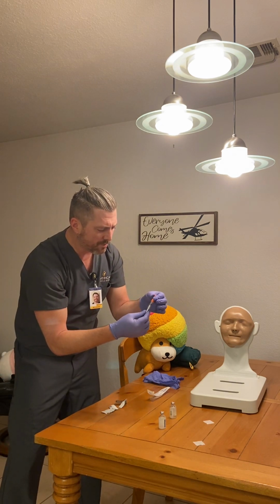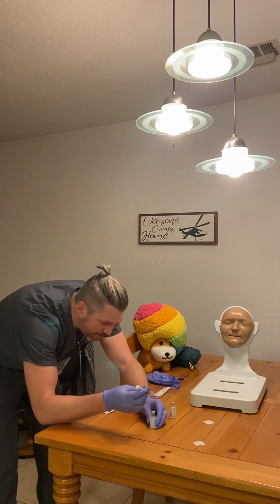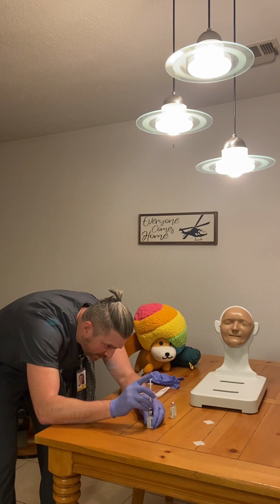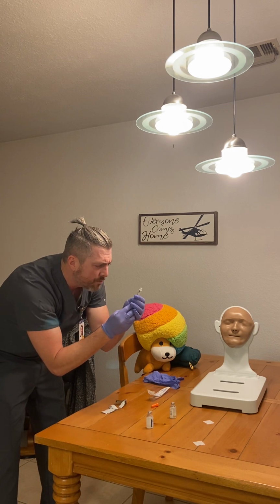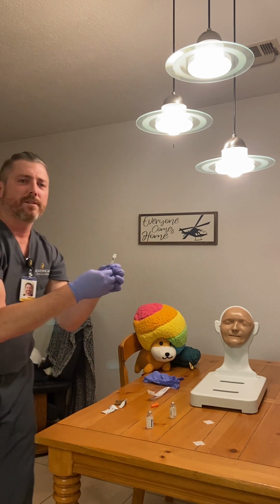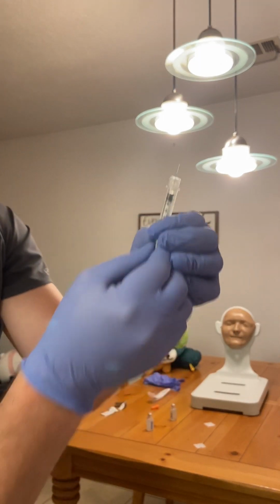I'm going to remove the cap. This is dry now. Without touching the needle to the medication, I'm going to insert the tip of the needle and inject all 8 units of air in there. Move it out. I'm going to draw up 4 units of air for the regular insulin with my nurse. And for the camera, 4 units there.